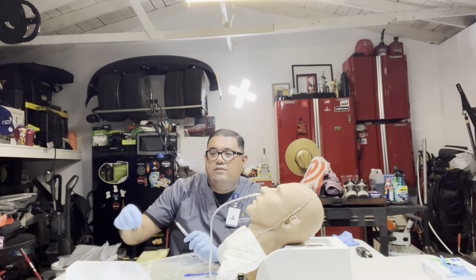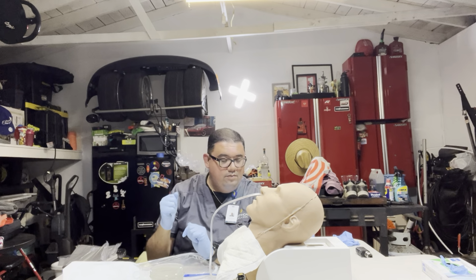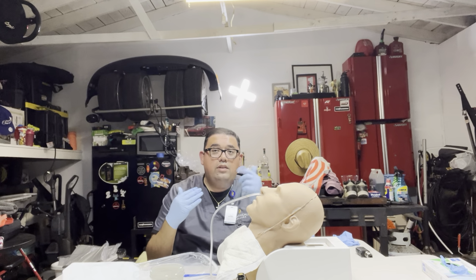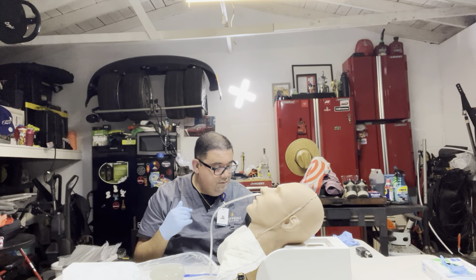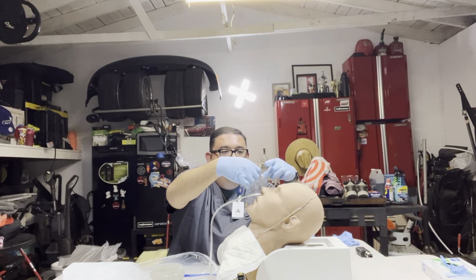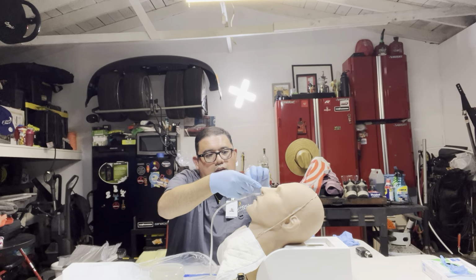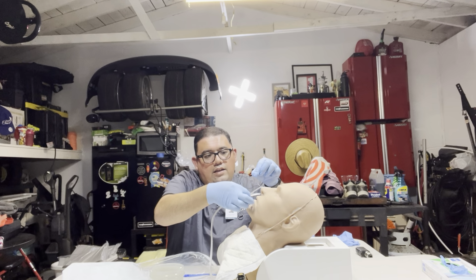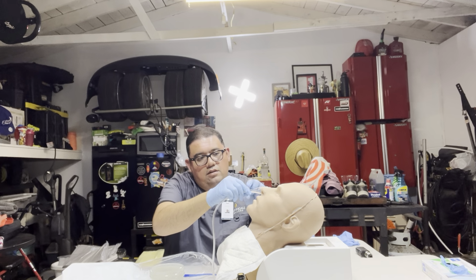Now that we have everything verified and everything looks good, we'll secure the NG tube to the patient's nose. Have my tape here. I'm gonna place it on the bridge of the patient's nose. I've made these little slits in the tape, little legs to help wrap the tubing around. So I'm gonna take the first leg and wrap it.